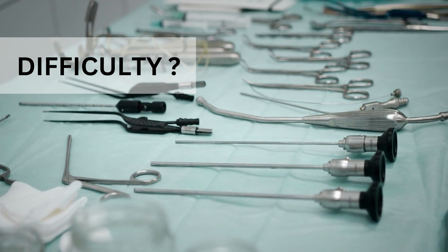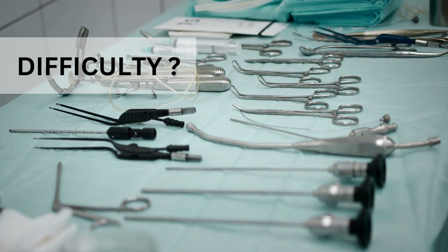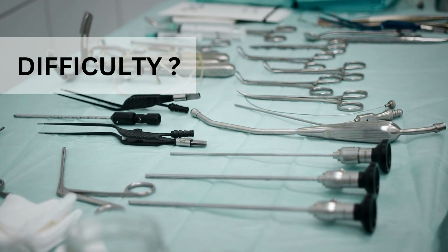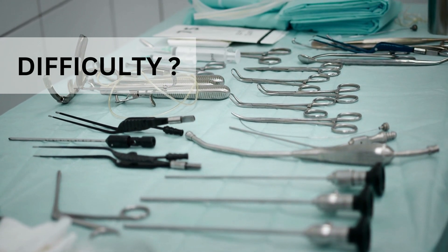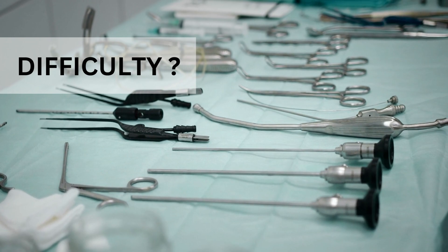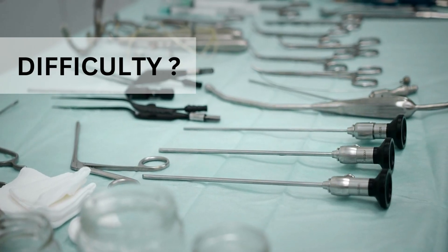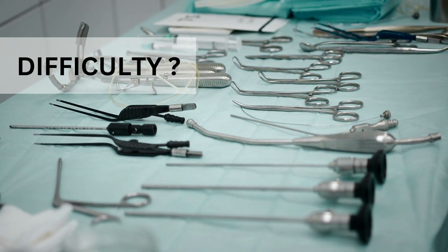Laparoscopic instruments are very difficult to clean and disinfect because of the presence of many lumens and channels. They have very complex geometries with spaces and crevices where cleaning instruments and chemicals cannot reach. So there is a good chance of organic matter lodging into those spaces and lumens.